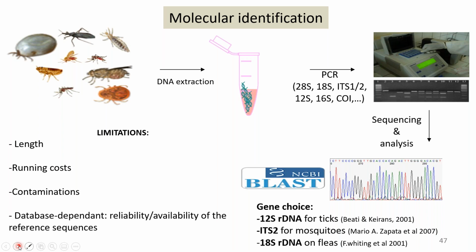Aside from that, molecular biology can be lengthy. It is definitely expensive. The running costs can be crippling depending on the kind of lab you're working in. And you are also dependent on the database. The problem with GenBank is that you have to trust what is put there. And sometimes the reliability of the sequences is questionable, but sometimes the sequences are just simply not there.